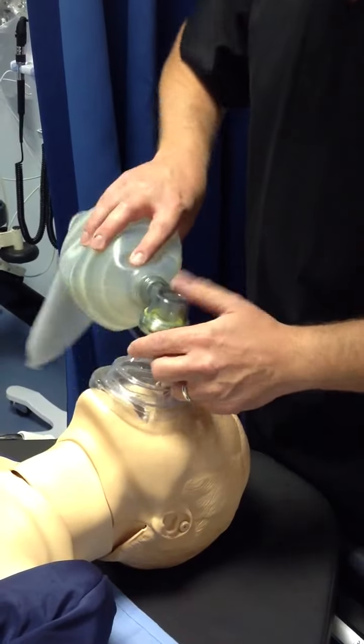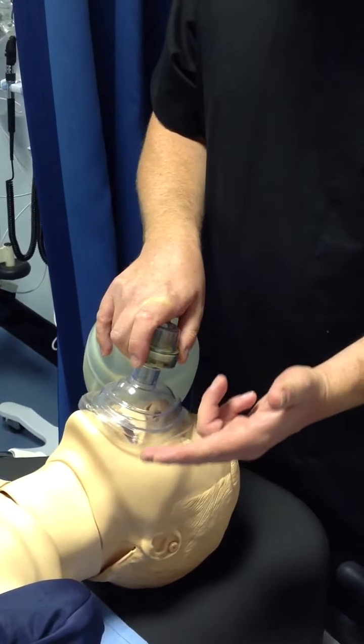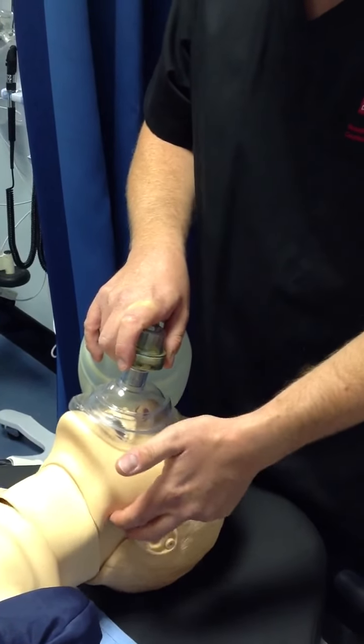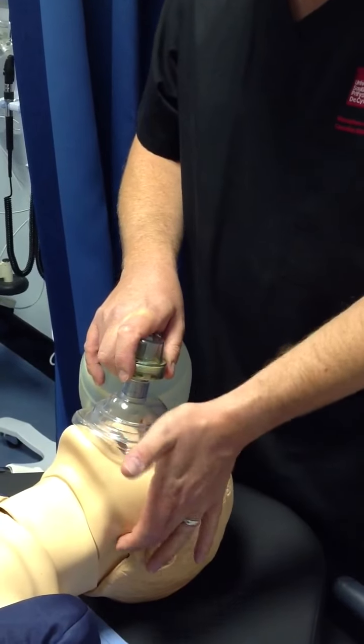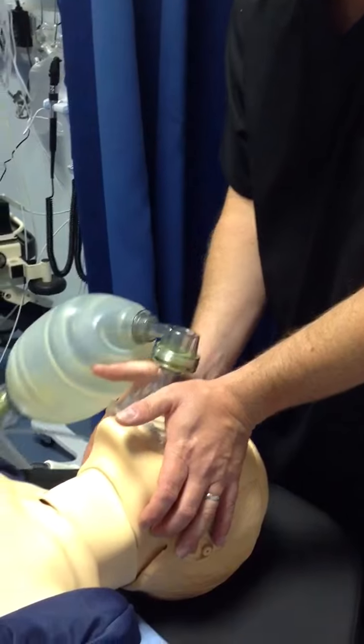Attach your Ambu bag. The easiest way to maintain an airway is to use your first finger and your middle finger. Place these at the angle of the jaw, just below the ear, and use the heel of your hand on the hard part of the mask on both sides.